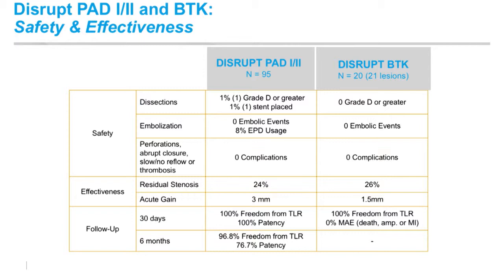If, for example, you have a patient who has a single vessel runoff and a bunch of tiny little geniculate collaterals, if you use orbital atherectomy or some other ablative technology, then you can potentially get distal embolization and turn that critical limb ischemia patient into an acute limb ischemia patient. So the fact that there have been no cases of distal embolization, I think, is remarkable and something that we're very happy to not have to deal with, because it can be a major limitation.